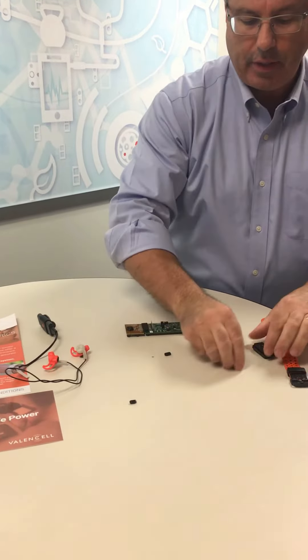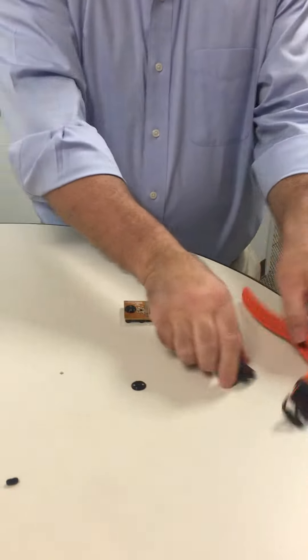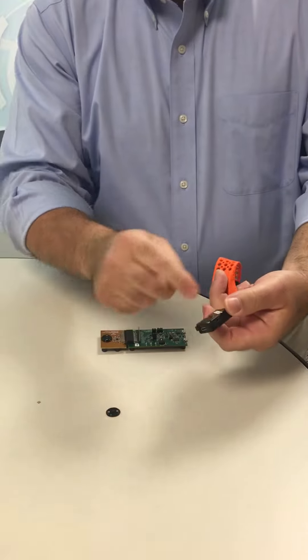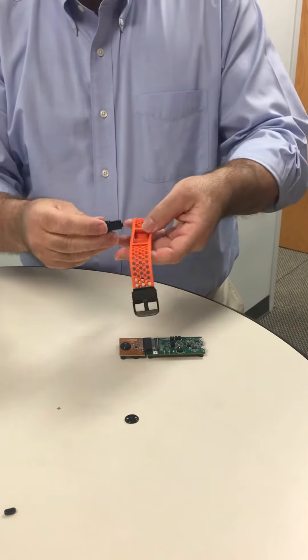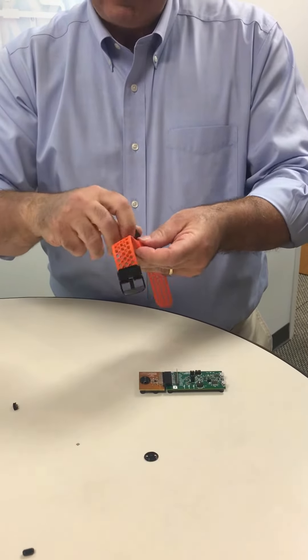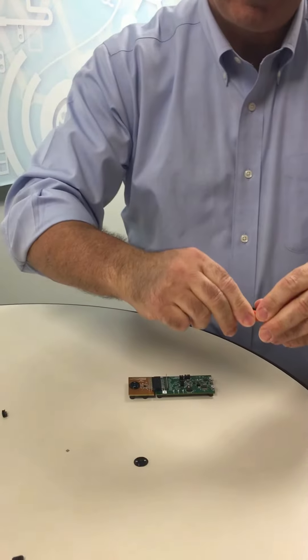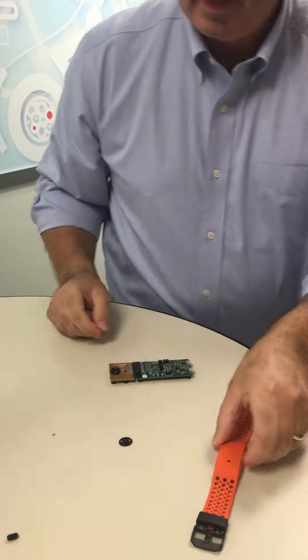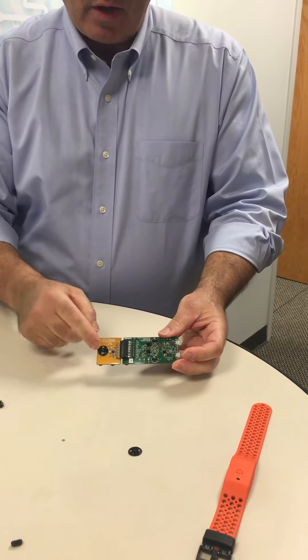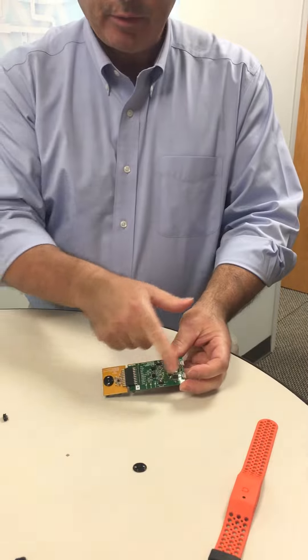The benchmark wrist evaluation kit has three main components. It has a wireless demonstration system — this is our benchmark wrist sensor with a BLE radio attached to it. It allows you to talk to an app on a mobile phone that receives the Bluetooth heart rate profile. We also have a USB development board with a daughter card. The daughter card has any one of the sensors we make; in this case, it's got benchmark wrist.